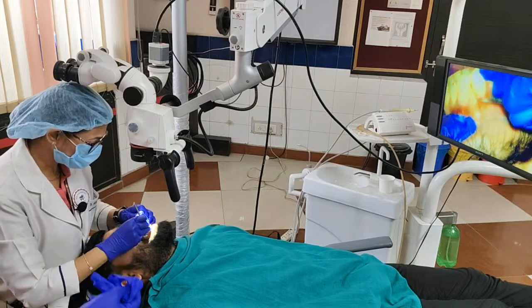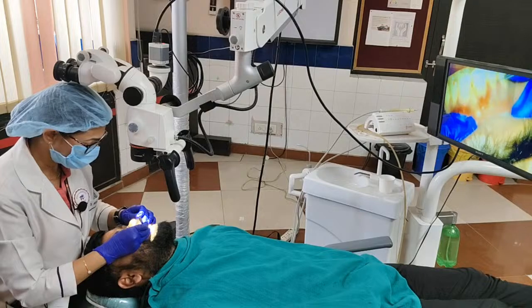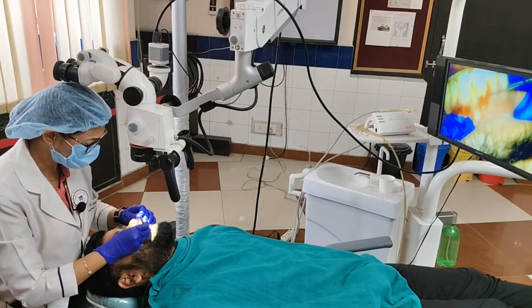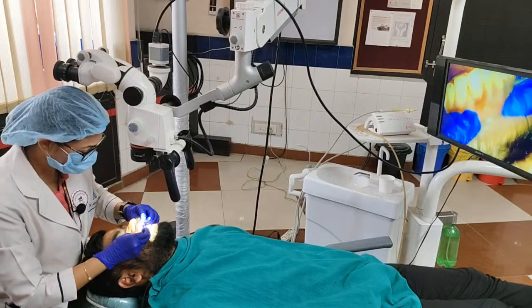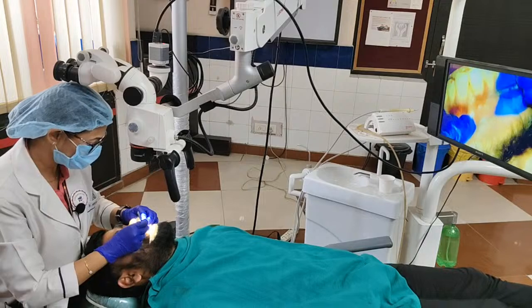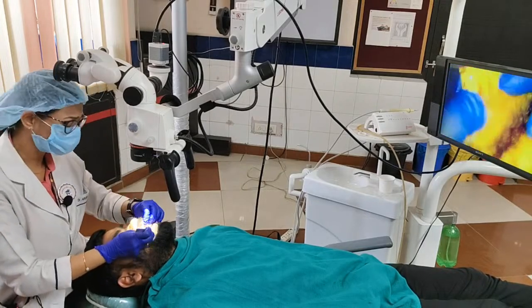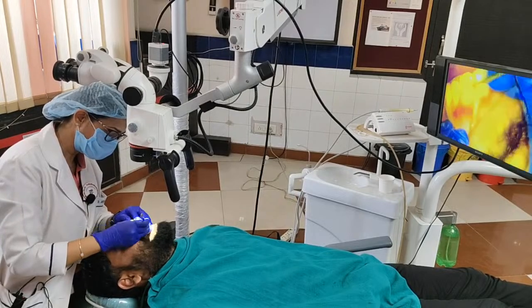This patient is indicated for frenectomy also. So I think one batch can see the frenectomy, and 2 or 3 batches can do the lower. Yes, definitely. So likewise, we can segregate a few patients so that all of you students have to do this exercise, okay? The microscopic partial thickness raising of the flap.